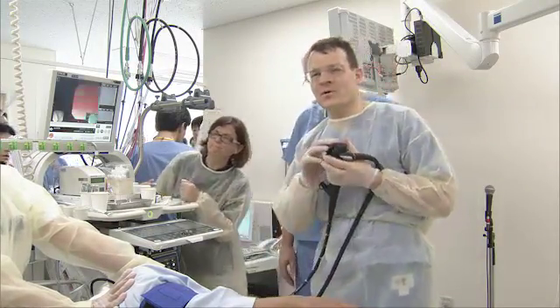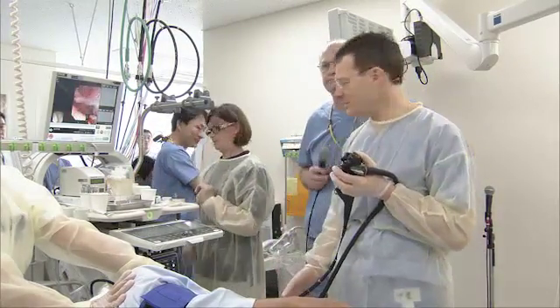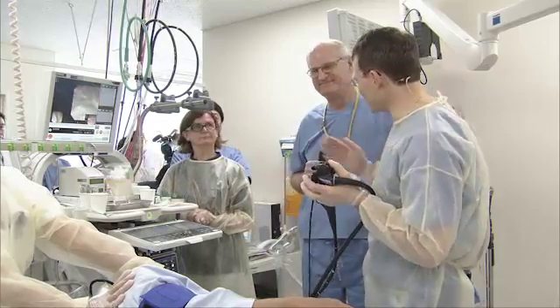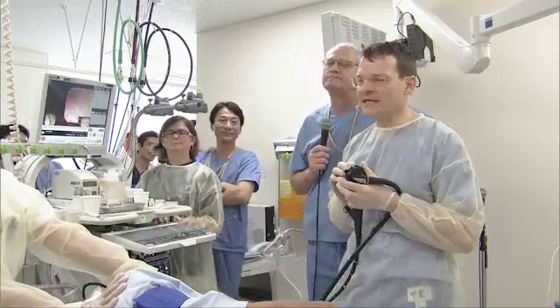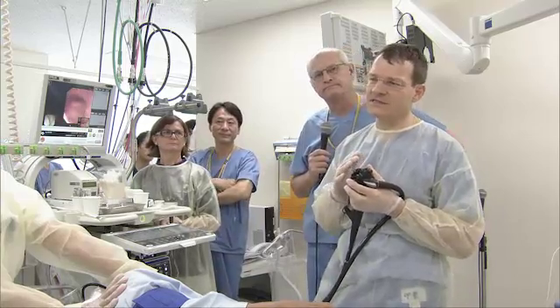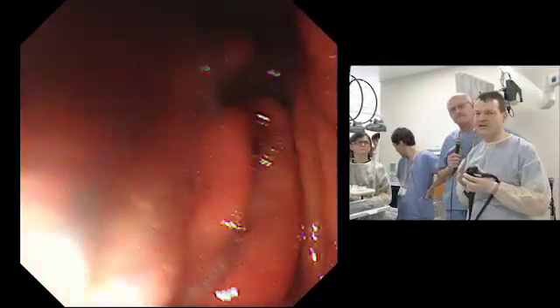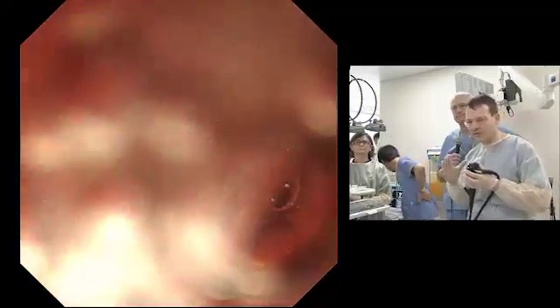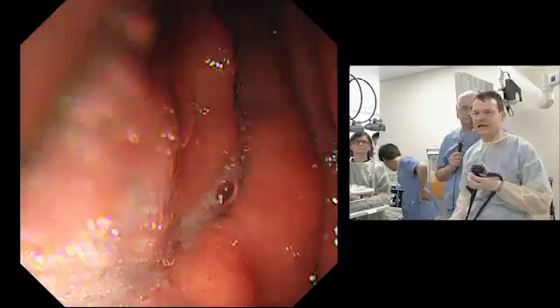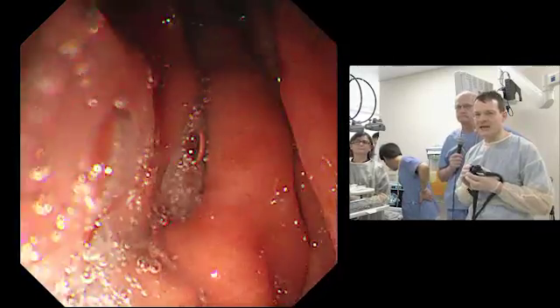Okay, so we are happy to welcome you here from the EUS suite, and I'm very happy to be together with Rob and with Ryozawa, because we have a very interesting case, and we also would like to discuss the strategy with you. So EUS always implies a strategy for the patient because we want to influence somehow the decision making for the patient. And you have seen in the pre-announcement, this is a patient.